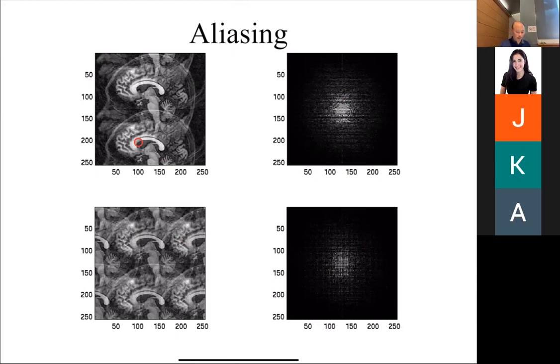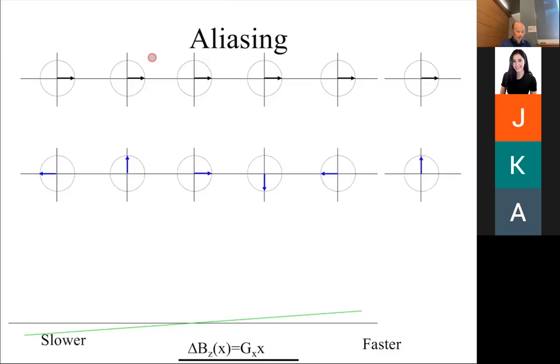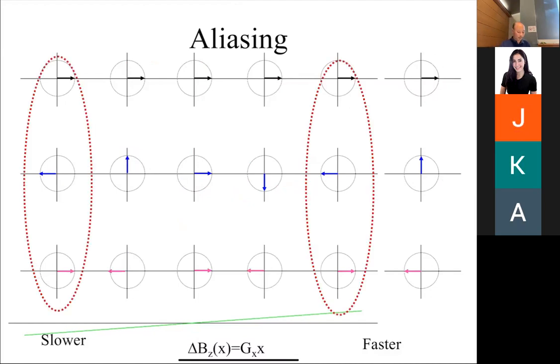So that's the roadmap. Let's talk a little bit about why we get aliasing in MR. Remember, if these are my spins, for this course we always imagine you're just starting off at kx equals 0. Then we take a step, and you can see this spin here is at the isocenter. It doesn't change. This one advances, this one goes backwards, and so on. And we take another step and they keep advancing in phase, or they keep going back in phase, okay?